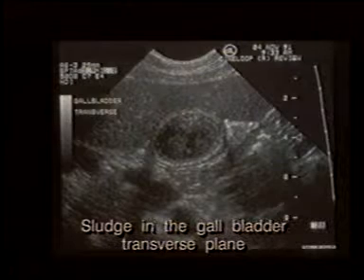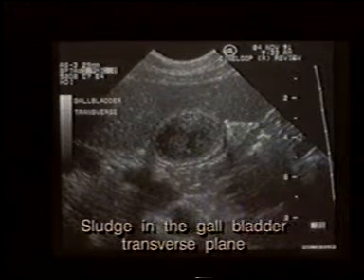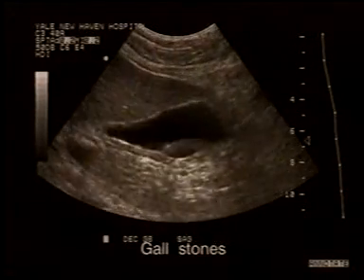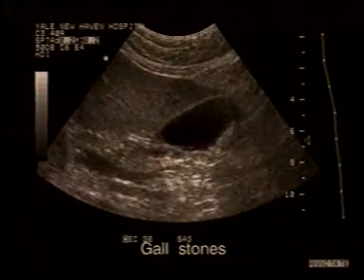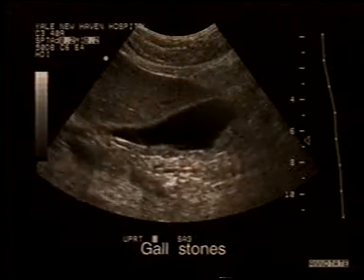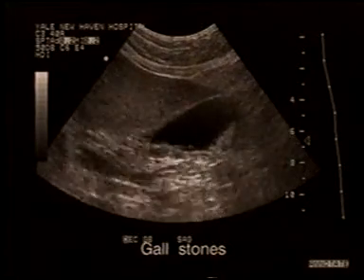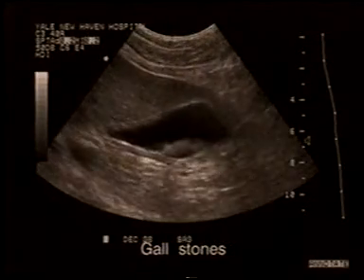Many images that claim to show sludge are actually showing artifacts. Sludge is thick and moves slowly, trickling down the gallbladder. Unlike kidney stones, gallbladder stones move. They appear as white masses with a shadow, and sometimes it is necessary to use a higher frequency transducer to demonstrate the shadow. By moving the patient's body, you can identify stones within the gallbladder with 100% confidence when you see them move.